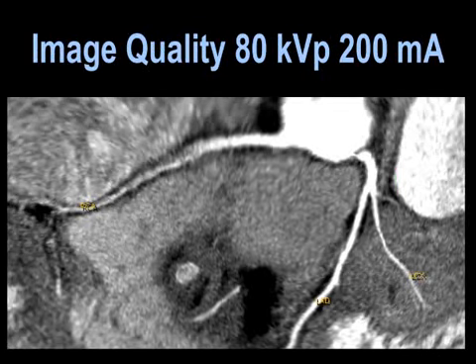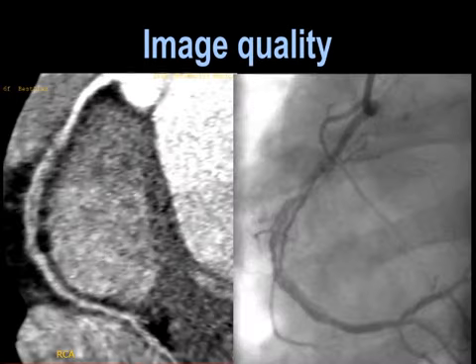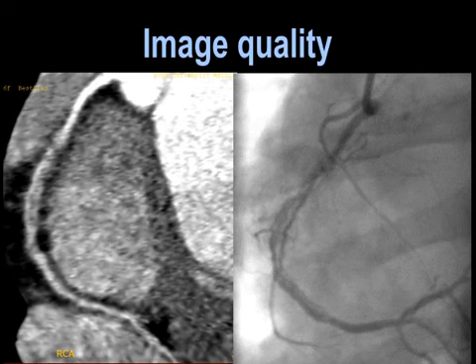An example of a sort of curvilinear reformats. This kid had Kawasaki's disease. It's a vasculitis that affects coronary arteries and other medium arteries. And I'll just show you the right coronary artery here. Was really thready. This is what it should look like all the way through, and see how it gets a little thready here.